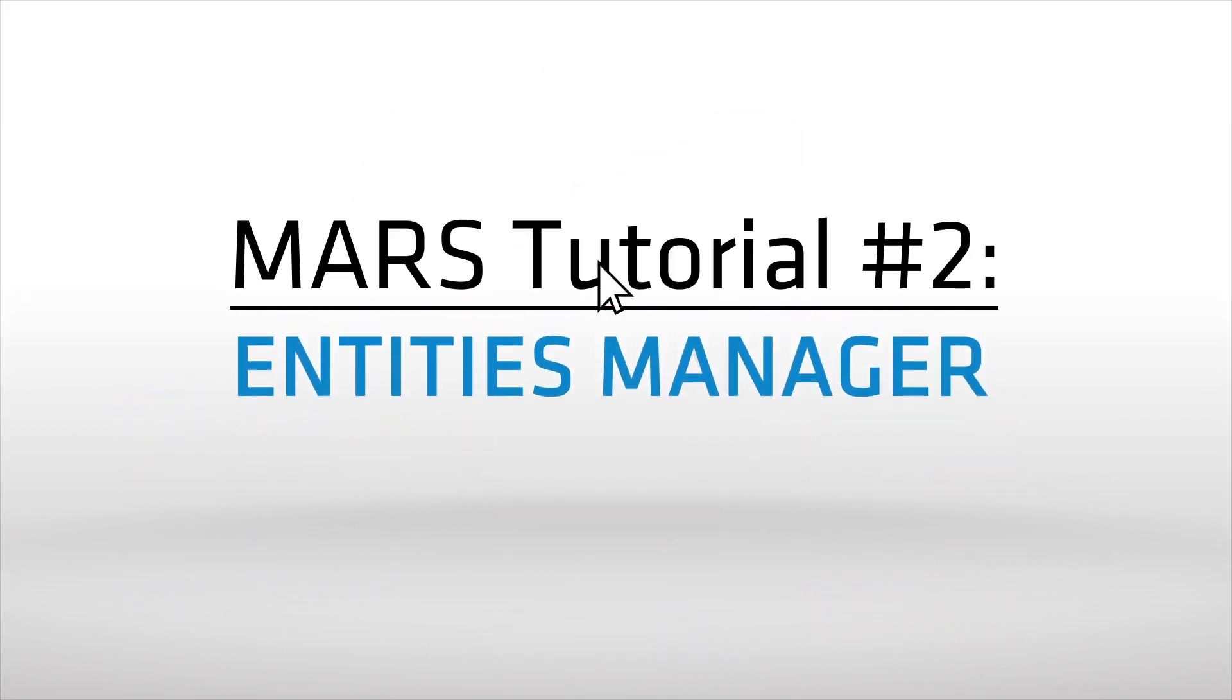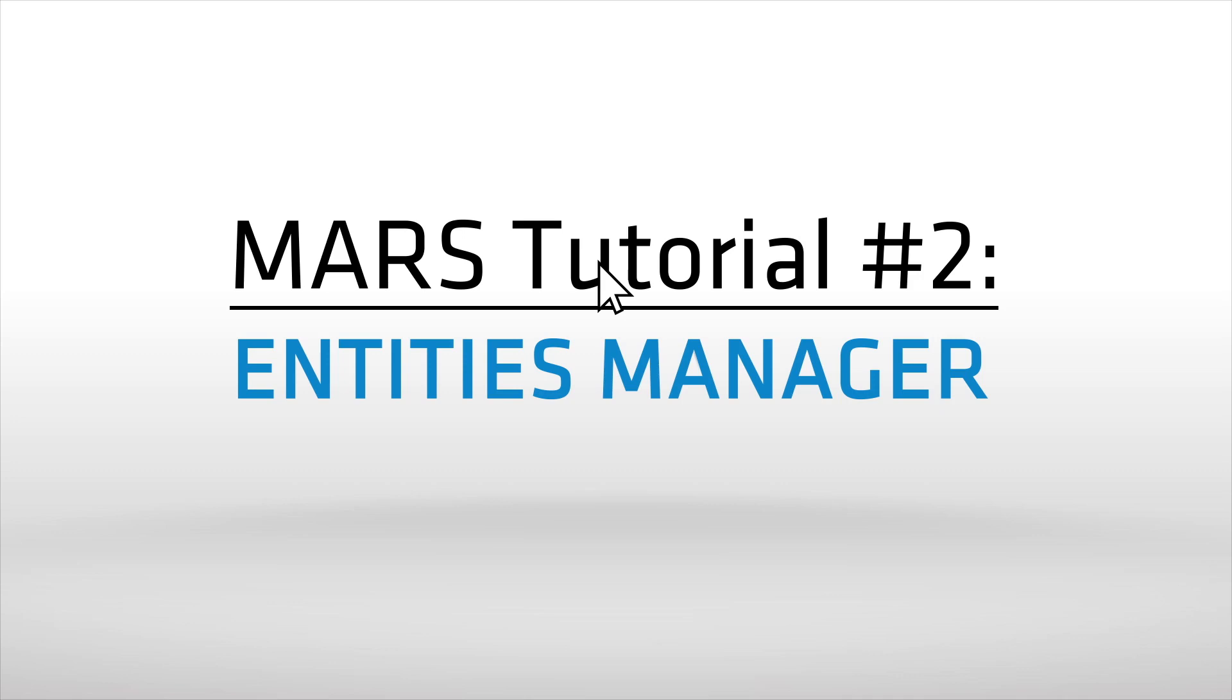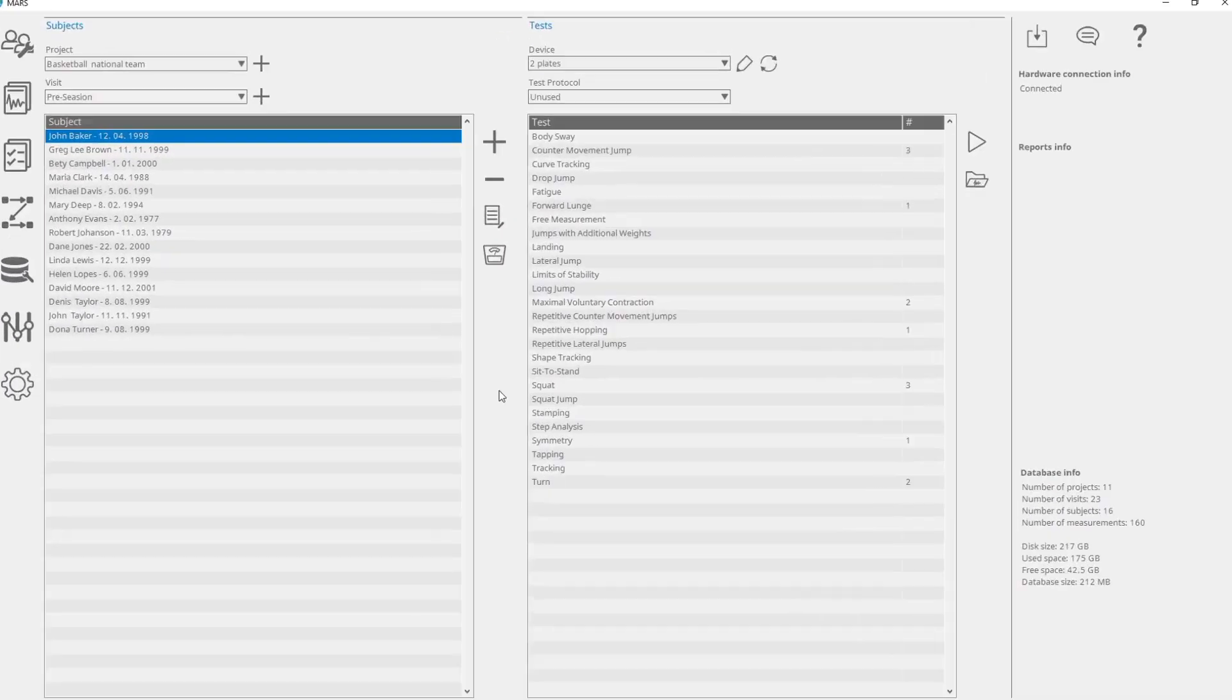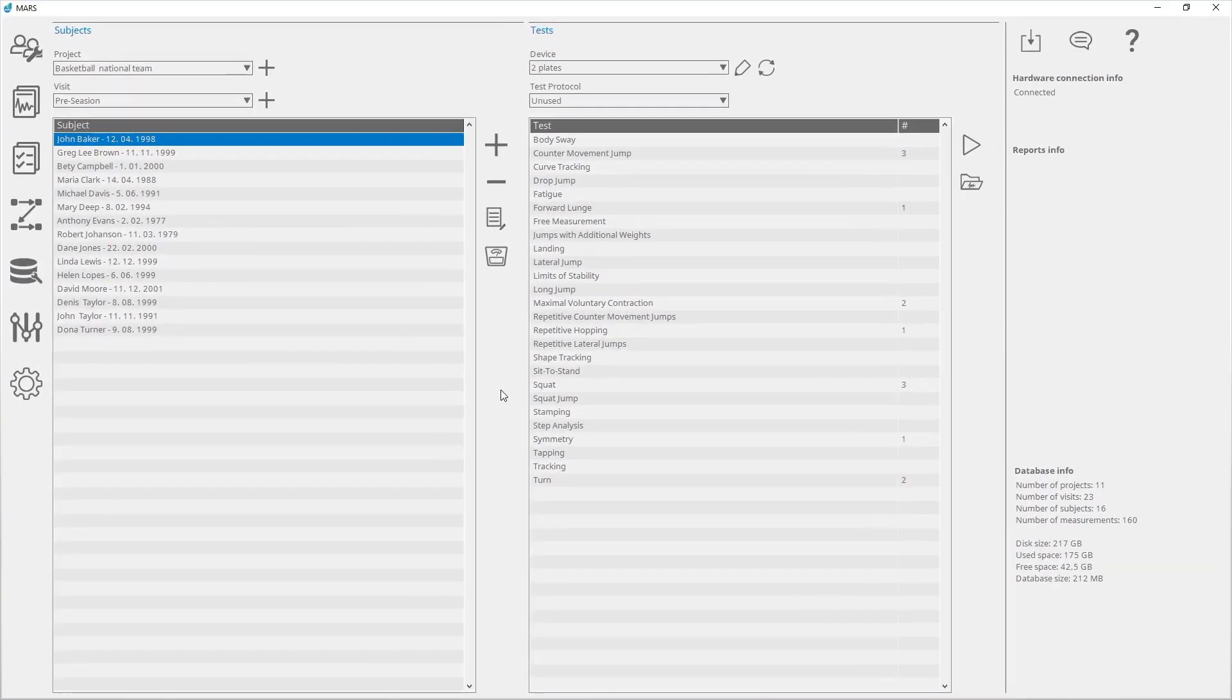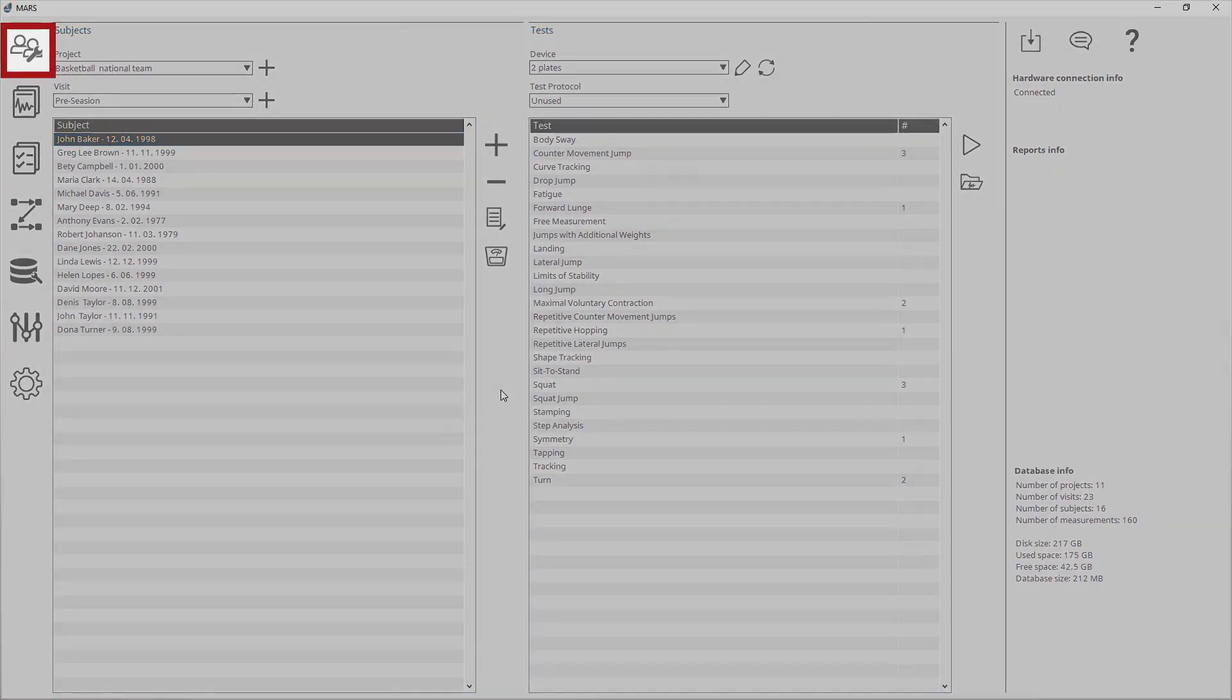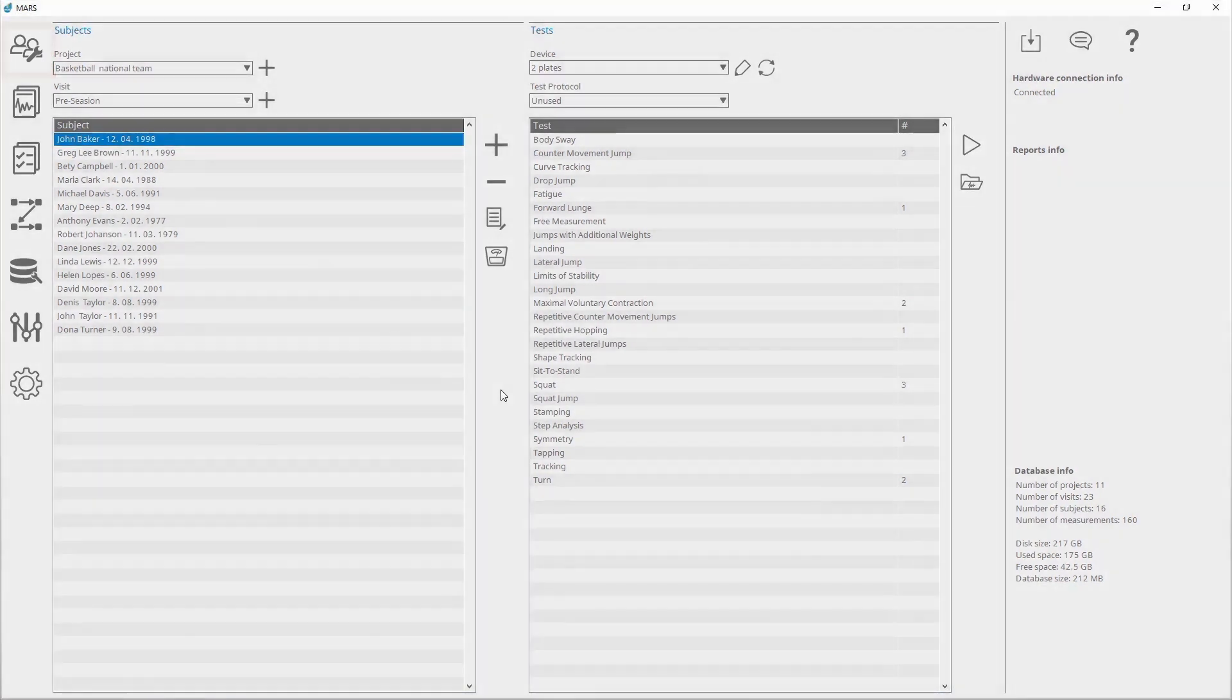The Entities Manager is used to create, edit, and delete projects, visits, and subjects. Enter the Entities Manager from the main window by clicking on the Entities Manager button.